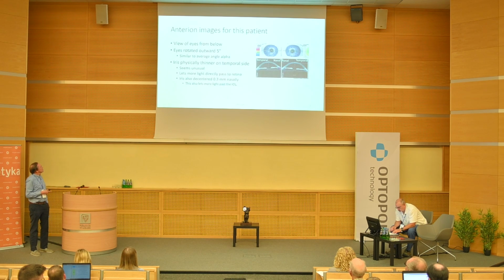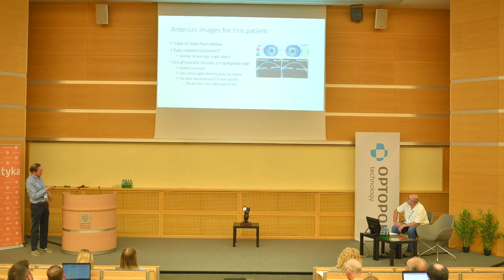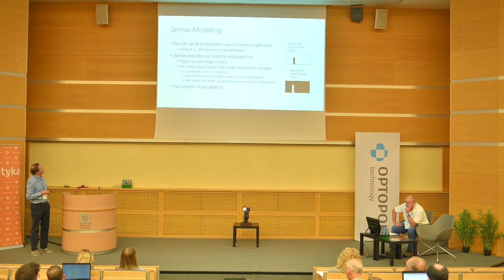I put this view of eyes from below. Before I was saying this, I hadn't realized the convention, and it could be that everybody knows this. There's a convention of displaying images viewed from below, and I suppose I have it on a separate slide now. I'll come back to it in a minute because I'll point out where it comes from.